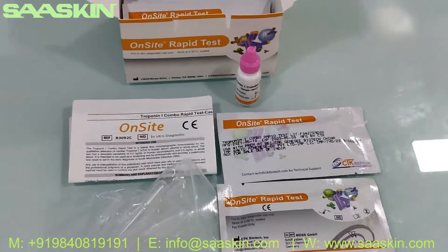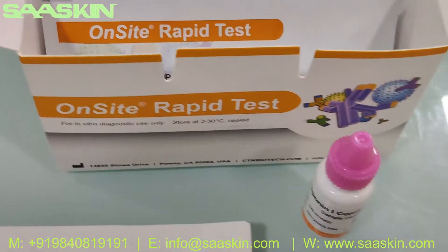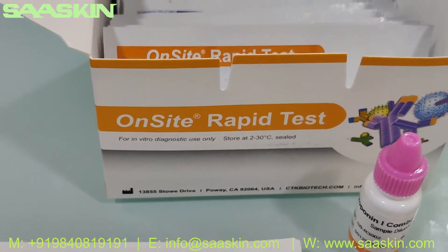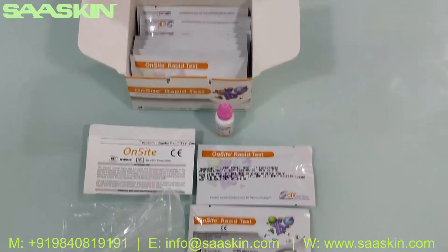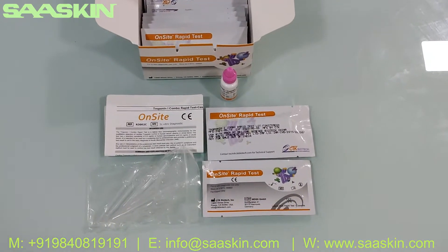This is the complete unboxing of the onset rabbit test for Troponin-I combo test. Thank you.